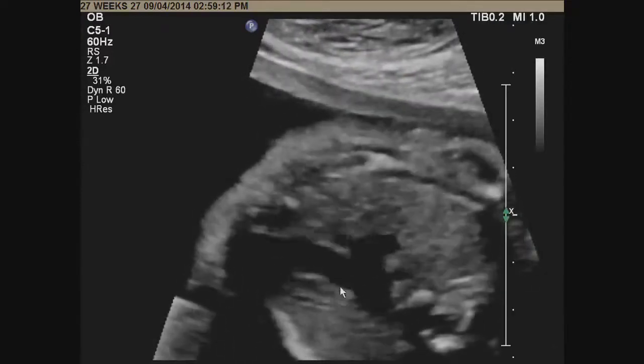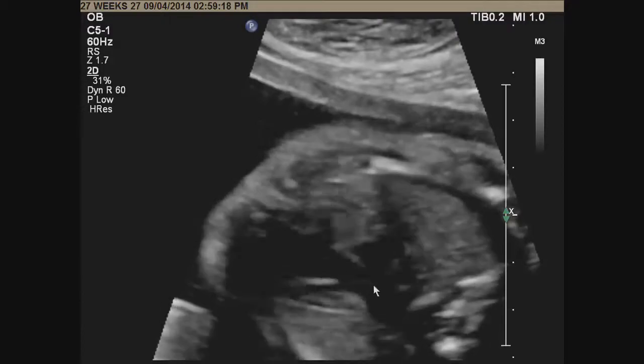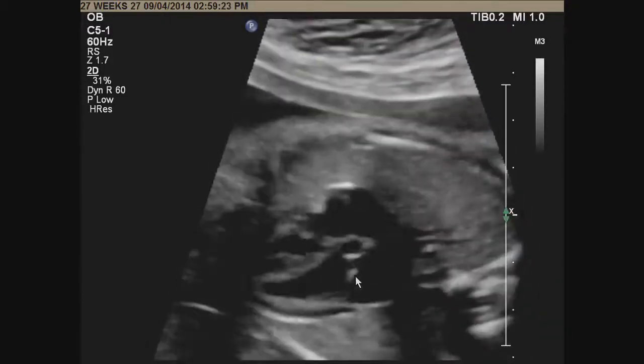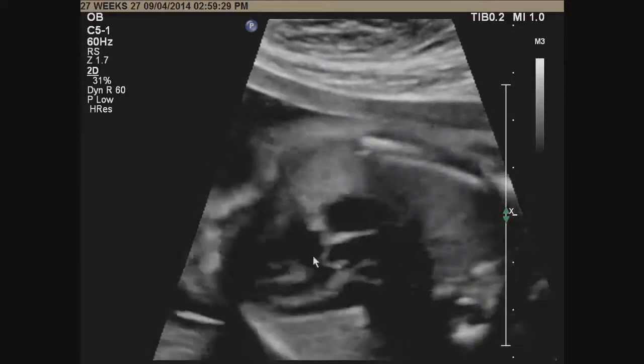So again, same features. You look at the pulmonary valve, make sure it doesn't go away during systole, and you look at the shape of the vessel. It should be slightly larger than the aorta. And as I go into the transverse views in the upper chest, you will see how we can assess the size of the vessel. So let me do that now.